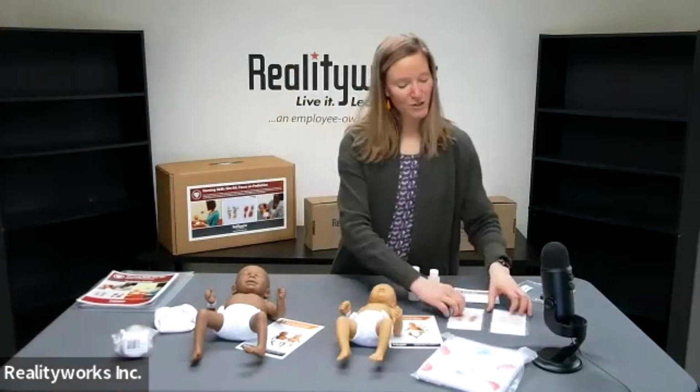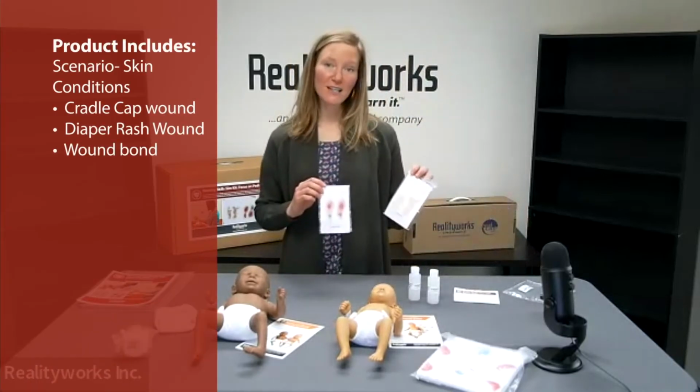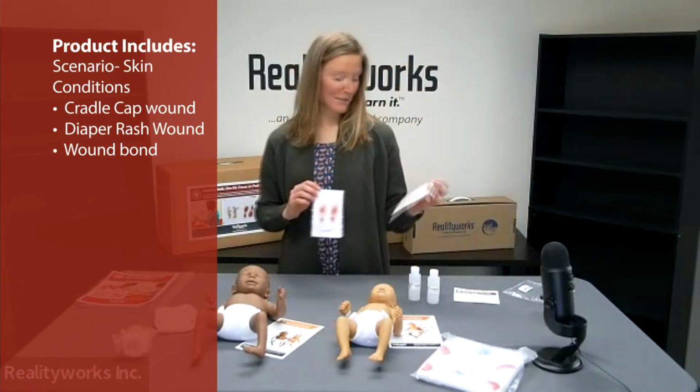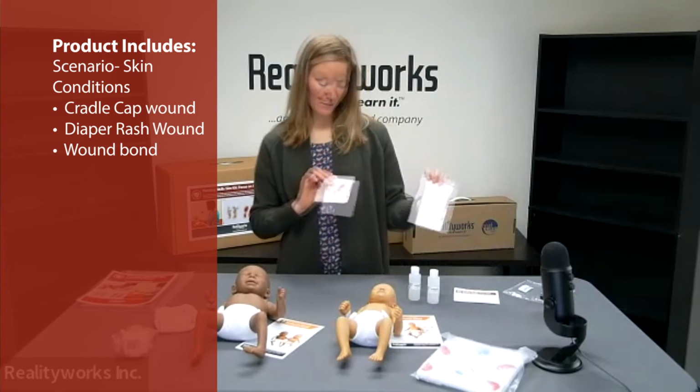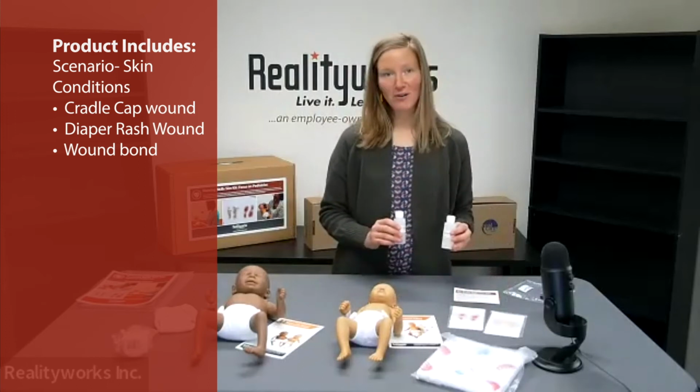Your students will also practice caring for an infant with skin conditions using the realistic models that accompany this kit. Specifically, you'll get a cradle cap model, a diaper rash model, and wound bond, so you can make that scenario even more realistic.